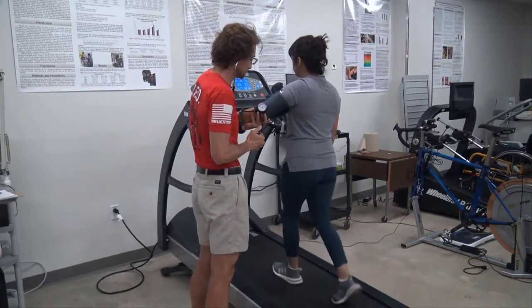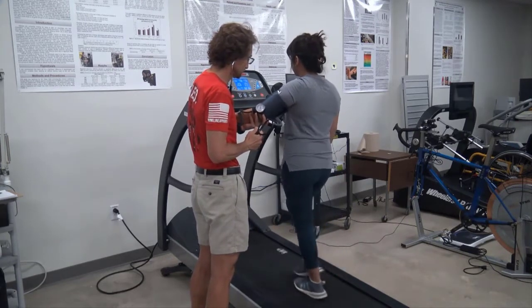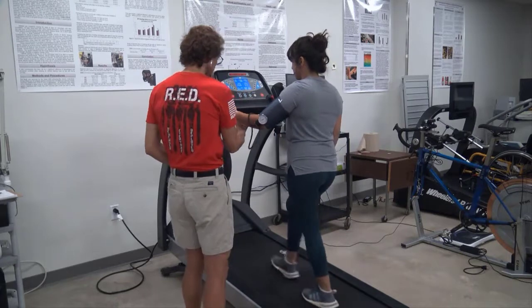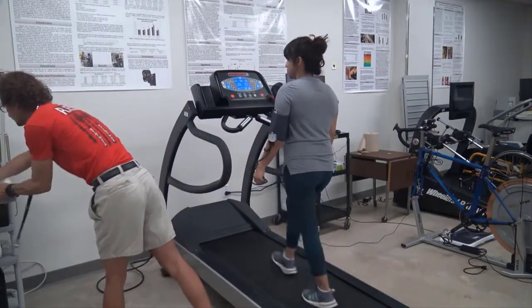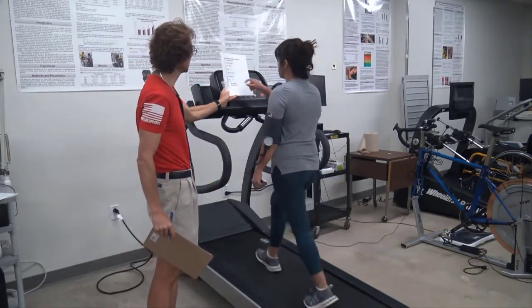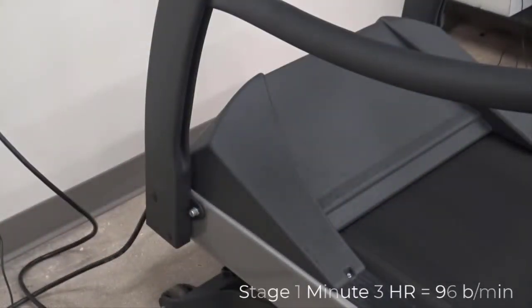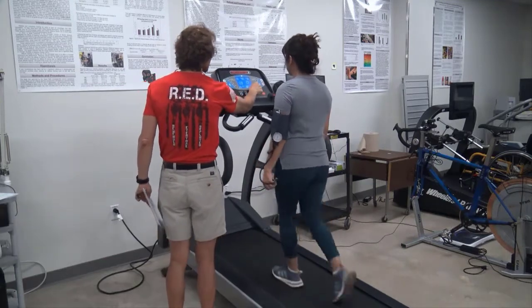When taking blood pressure, follow the procedures outlined in the blood pressure tutorial. Notice how the arm is cradled — it should not be resting on any part of the machinery and should be relaxed in the administrator's hand. If you're a little slow taking blood pressure and run over three minutes, that's okay — going a few seconds into the next stage is not going to make a big difference. The main thing is to not panic or lose control. Once you have finished taking blood pressure and RPE, record the data and note the time as you increase speed and grade into the next stage. Heart rates for minute 2 were 93 and minute 3 were 96 — within the 5-beat parameter for steady state — but we must proceed to the next stage because her heart rates are well below the 110 beat per minute minimum.